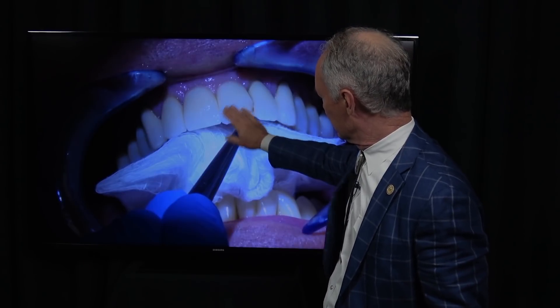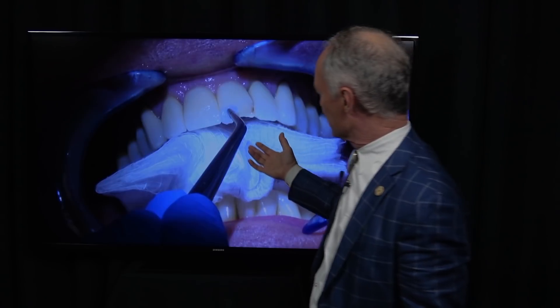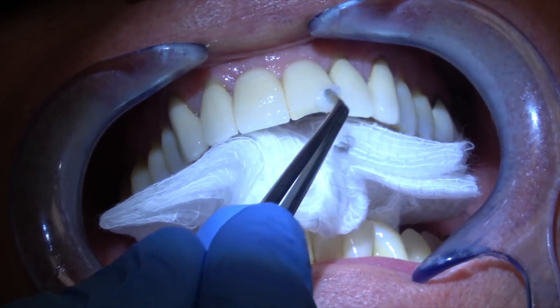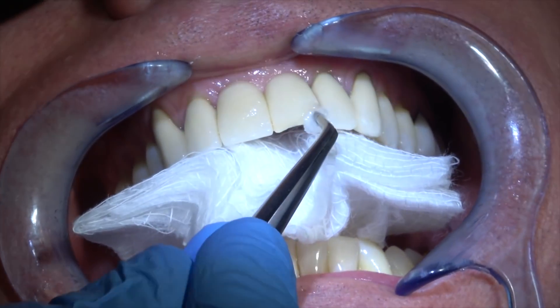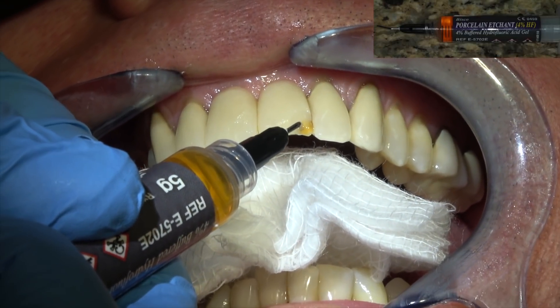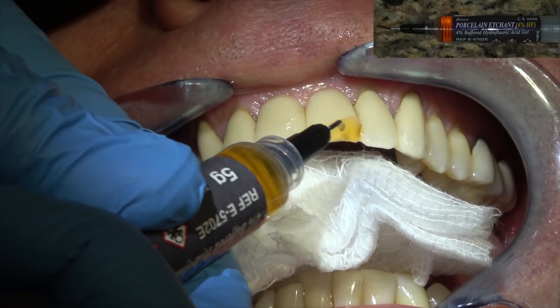The first thing I've done is just roughened this area. If it's a fresh fracture and the porcelain is clean, you don't really need to roughen it — it's jagged enough already. Now I'm scrubbing it with isopropyl alcohol on a cotton ball. You don't have to rinse it off.